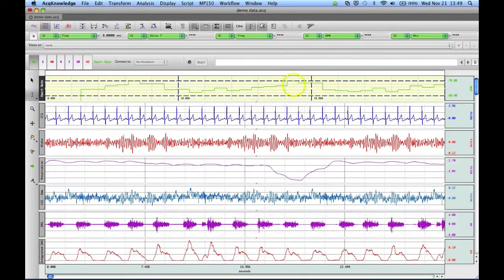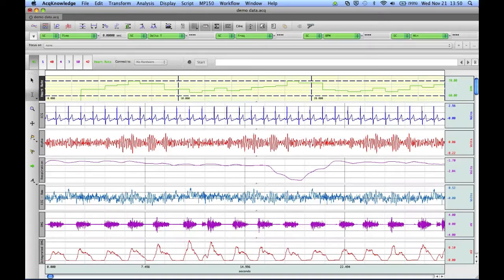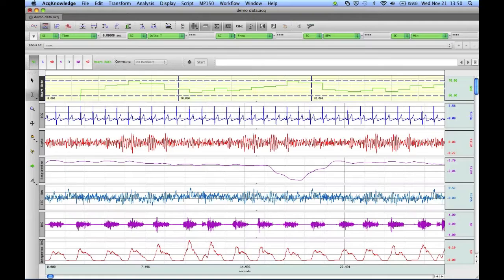And what this does is this just allows you to set up your grids in a way that you find useful during your study. Now, if you find a grid configuration that you'll find useful for future recordings, what you can do is save them as a preset.